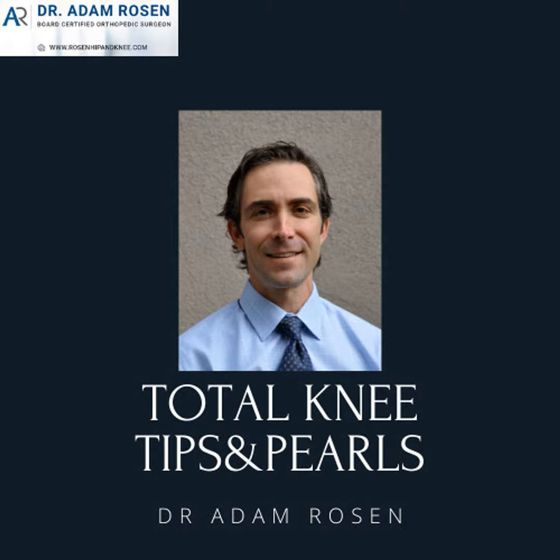Where I think, nowadays, a lot of us get into massive bone loss, you just drop your cone, and you can freshen up the bone if there's still bone high on one side, and build everything off of that. And so it's made lives a whole lot simpler due to all these great new tools that we have in our armamentarium. But again, you need to be prepared. If you're not prepared, that's where you're going to get caught with your pants down. And unfortunately, the person that's really going to suffer at the end of the day is your patient if you give them a less than optimal implant that either fails early prematurely or is unstable and needs another operation.